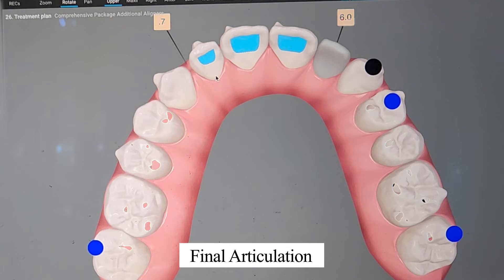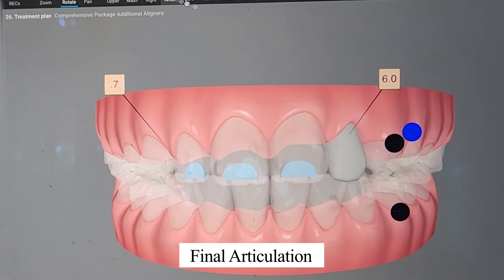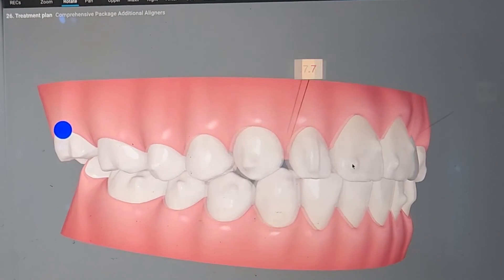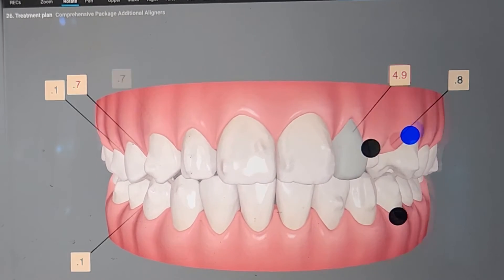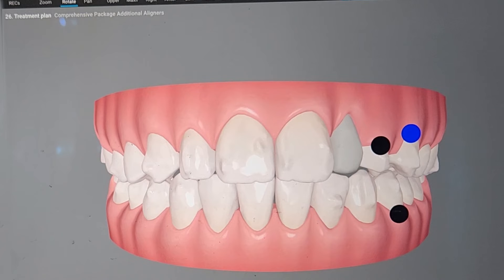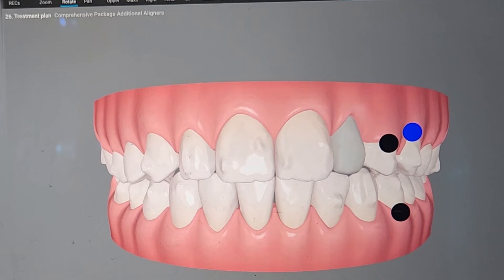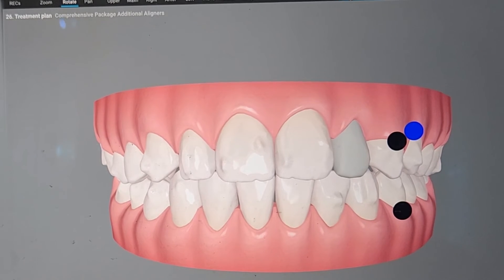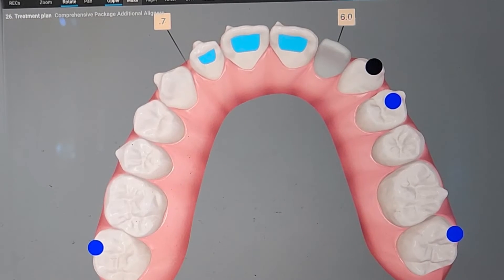Beyond that, I'm gonna go ahead and look at the movements and see if I like the way things are moving. Usually I do a quick play from the front. Now this one has already been intentionally slowed down. I'll usually double my trays once I get the movements that I want, but I wait till the end. I repeat the same thing from the other buttons.